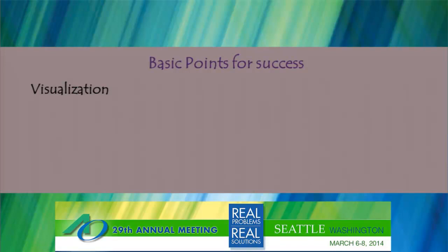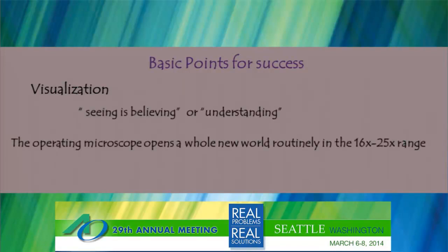Seeing is often said to be believing, and I will say seeing is truly understanding. If you can look at an implant situation long enough and understand what's going on in there before you attempt the retrieval, it is an amazing difference. With the operating microscope I'm using, normally I'm going in at about 16 power to take a look. I will bounce into 25 power, and they say that what you see is the square of the power, and it offers a huge advantage over just loupe magnification.